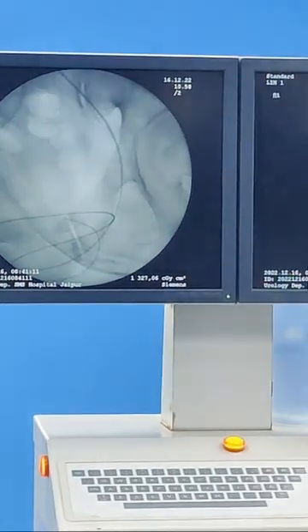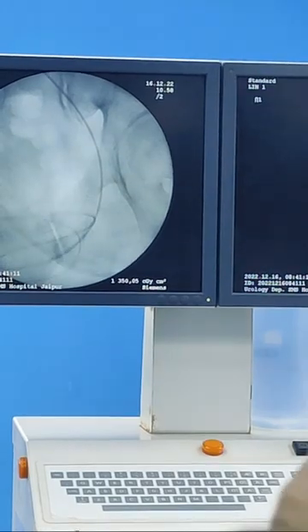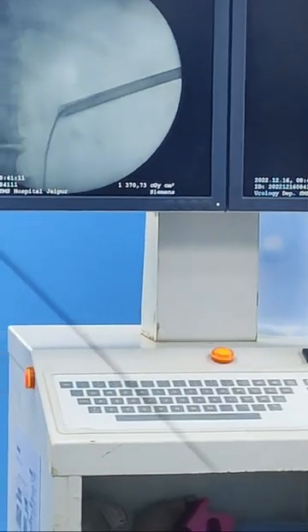So we have a lot of things, we are seeing the contrast, the guidewire is going now, the DJ has gone now. Can you withdraw? Why is it kept there?